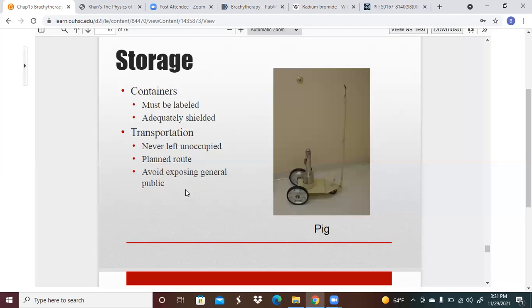The only reason that got caught, that those radioactive sources were actually being reused, was that some of the materials were going by Los Alamos, where they had detectors out near the road. They were going off, obviously, to detect if anybody's trying to escape with those kinds of sources. And then they detected that certain types of materials were actually still being used in general exposure to the public. That's the kind of thing that you want to avoid.